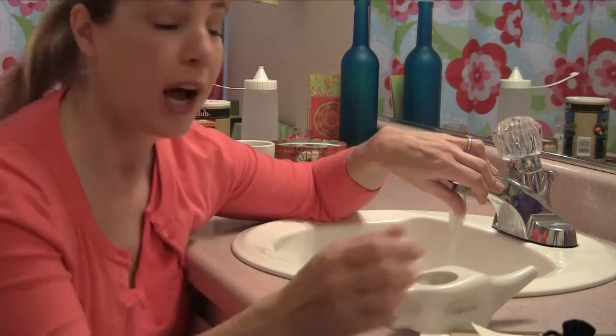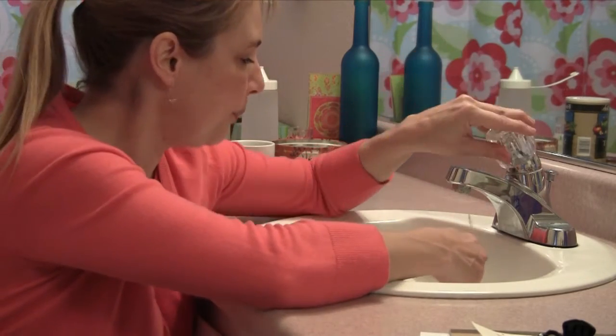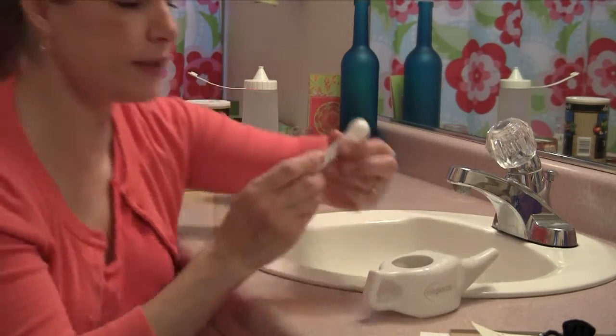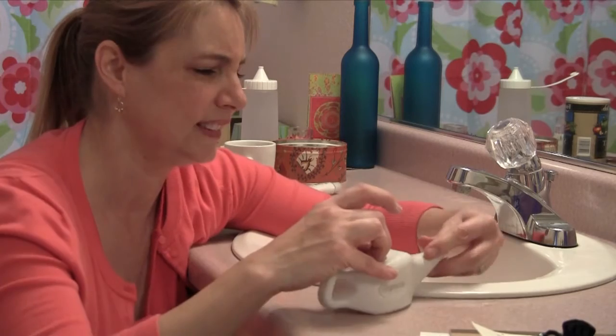Okay, so here's the deal. I'm getting body temperature water. I'm going to pour it into here, and I'm going to fill this little pot up all the way, okay? Oh, it's starting to pour out. Went a little too far. Oops. Okay, so then I want to stir it. So I take my little spoon and I'm going to stir this stuff up because I'm going to plug the end so it doesn't swish out all over my thing.